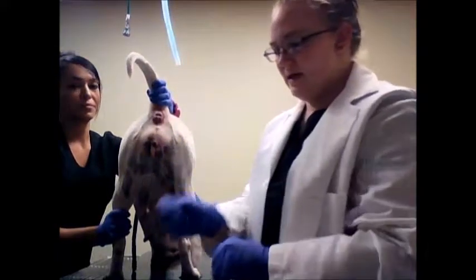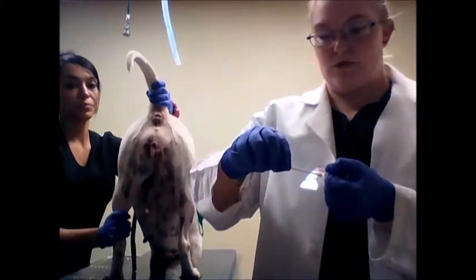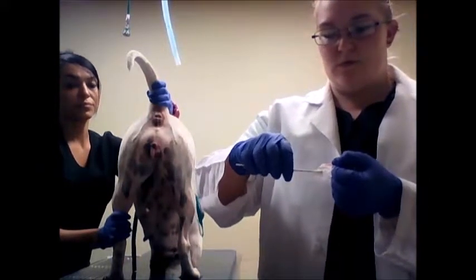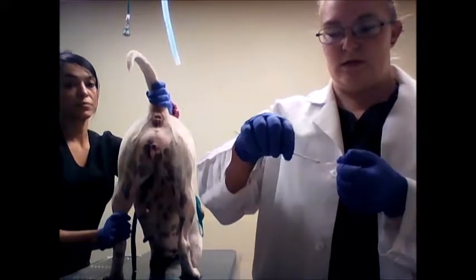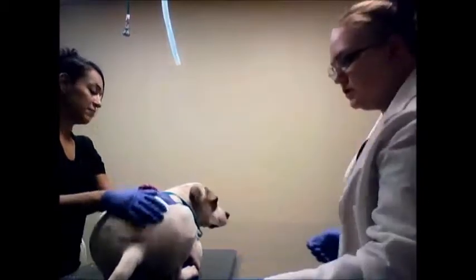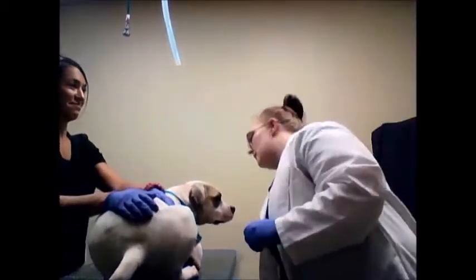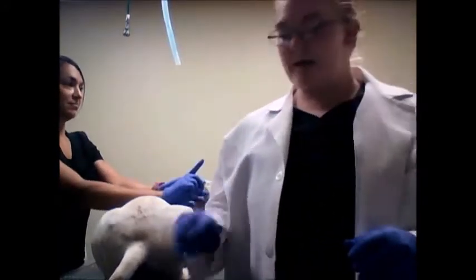Then we're going to go ahead and take our slide. We're going to roll the sample onto the slide. Looks like there's a little bit of bloody discharge on there, so she may be about to start going into heat. Then we're going to let that air dry and go ahead and stain that sample. Okay, so now we're going to stain the vaginal cytology.